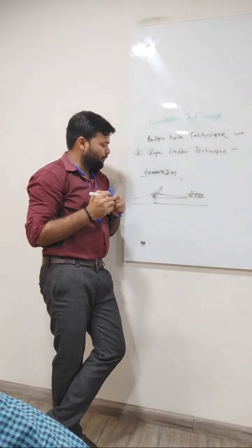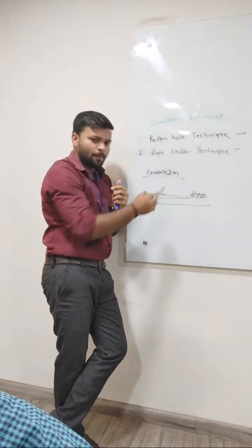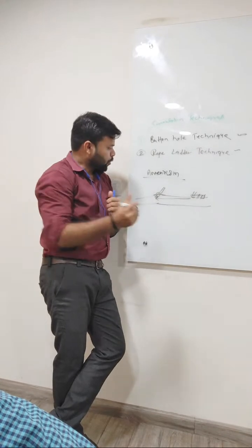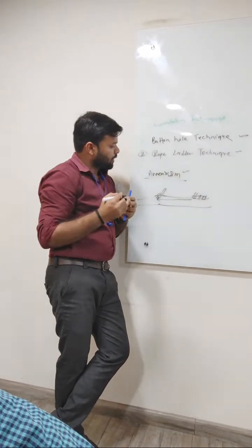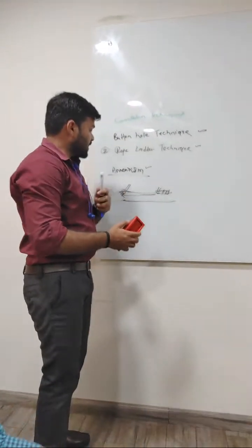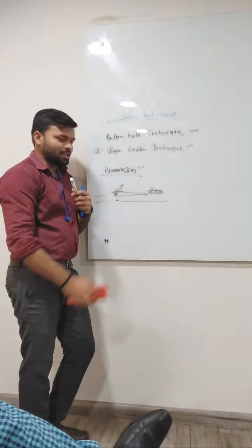If we choose the same point of the patient's fistula for multiple cannulations, there may be a chance of aneurysm. Generally, we should avoid this kind of cannulation in dialysis.